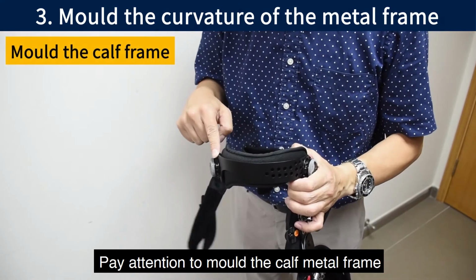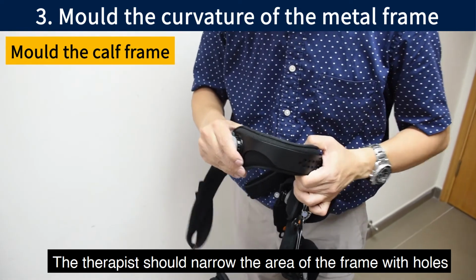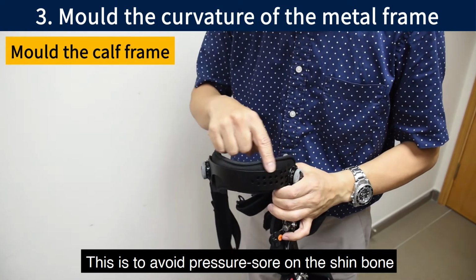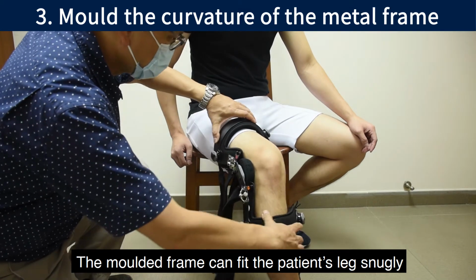Pay attention to mold the calf metal frame. The therapist should narrow the area of the frame with holes and widen the area of the frame without holes. This is to avoid pressure sore on the shin bone. The molded frame can fit the patient's leg snugly.